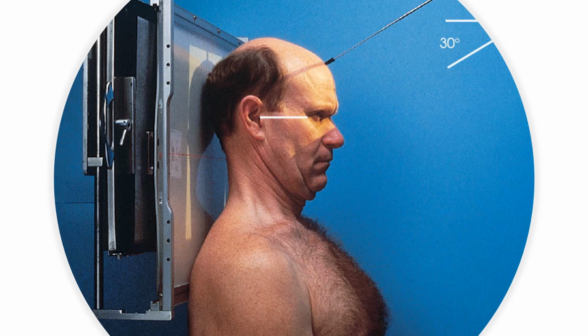So if you were to imagine where the patient's spinal cord was, right behind the ear, at the level of the base of the skull, and then draw a dotted line to where you think the sella turcica is, you should notice that that line is parallel to your central ray.